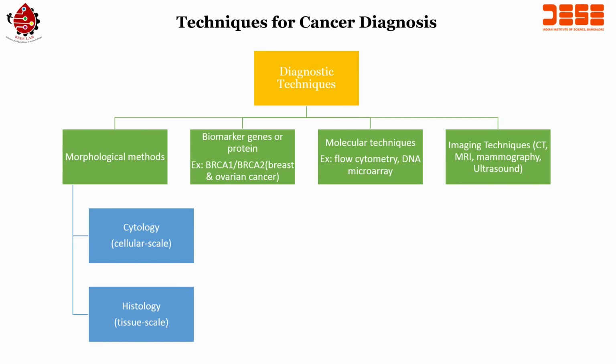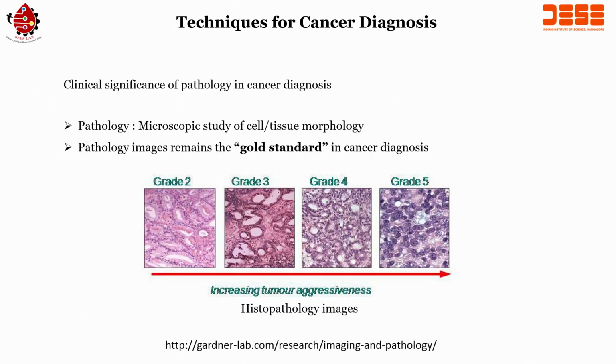We do not have that many experts, like I said, oncopathologists on site. Also it takes a long time to send the cells from the ground level to the oncopathology lab. So there is a waste of time, and sometimes a patient has to go to that laboratory. So, we are trying to develop a system using engineering techniques, so that we can do on-site screening of the patient in a case of oral cancer or ovarian cancer.